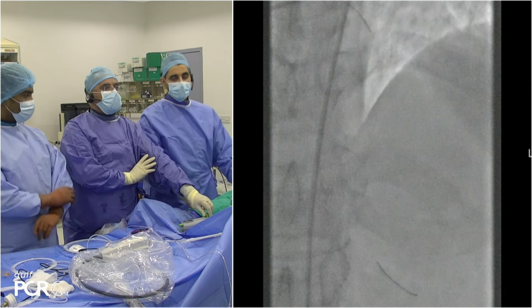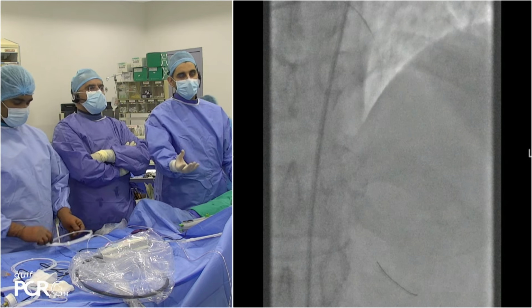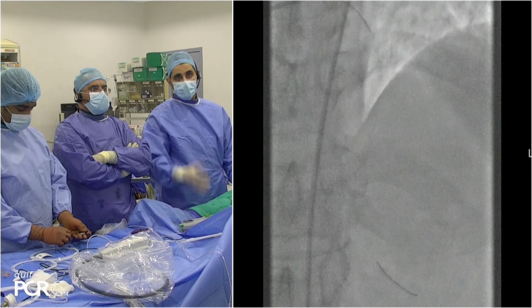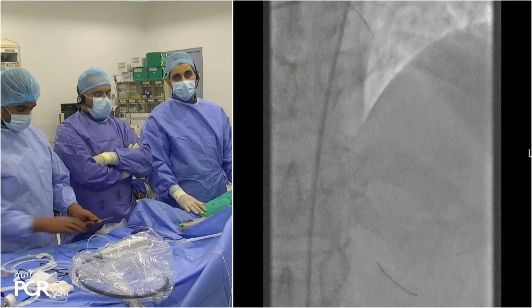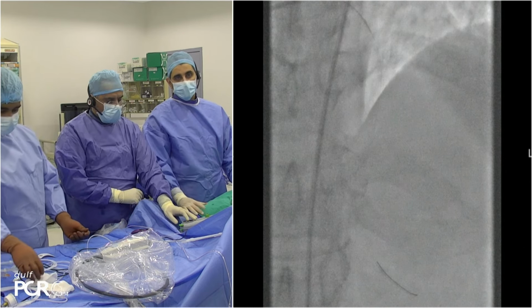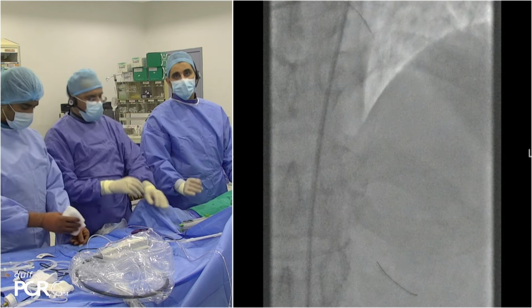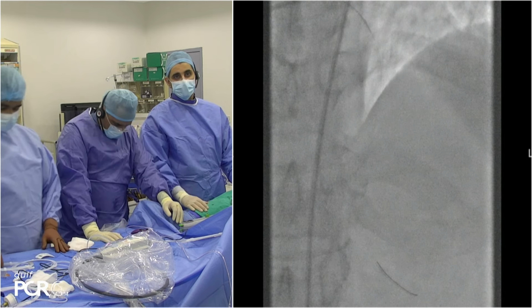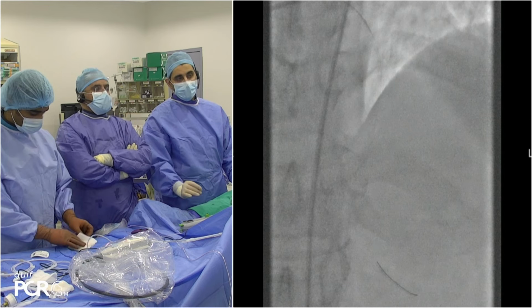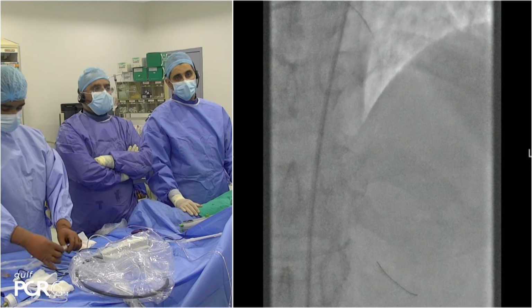So to be honest, the first thing I do, once I have a microcatheter in distally, I give a little bit of nitro and a little bit of nipride to maximize the flow in the capillaries, that allows any of the calcium that's been modified and dislodged distally to pass without causing slow flow. So that's the first thing. And the first run I do it really short, and then I do a quick fluoro with a little bit of contrast to make sure that I have good flow. Then I take my time moving the device in and out really slowly, as opposed to the pecking technique with the rotablation.